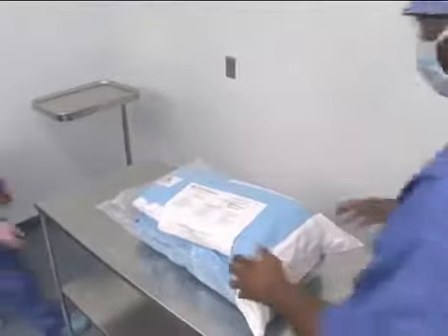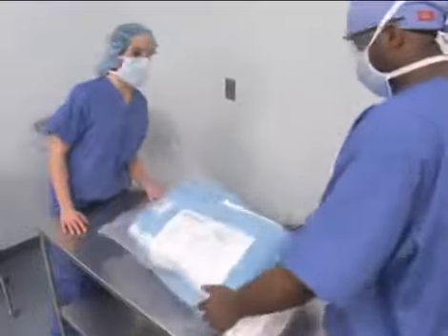Before opening any sterile pack, be sure to check the integrity of the outside of the package for strike-through and the external indicators for verification of exposure to the sterilization process.